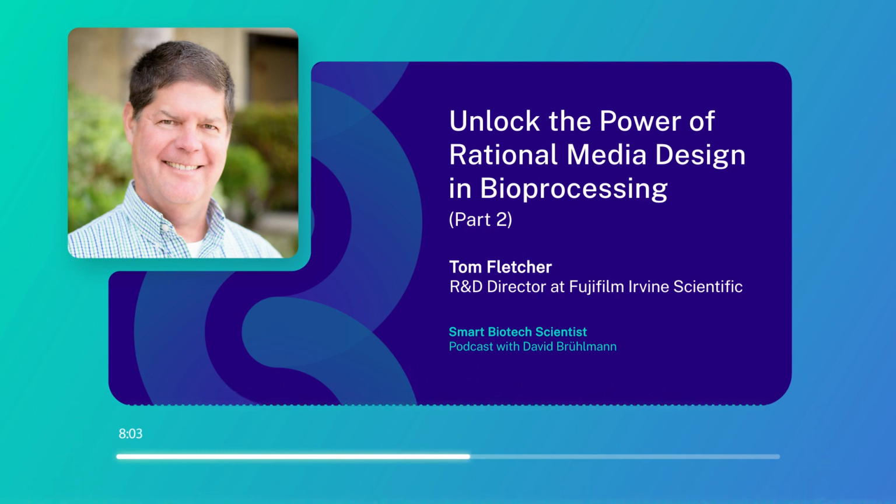Yeah, absolutely. Well, the practical issues can become the most important issues very quickly. During scale-up, people might realize, oh, wait a minute, there's some concerns about this formula and this particular medium. I mentioned previously some potential interactions, precipitations, solubility issues. But beyond that, the media preparation process is generally speaking quite a messy process. So it's typically isolated in a separate room from the other unit operations because the powder media can be very dusty.